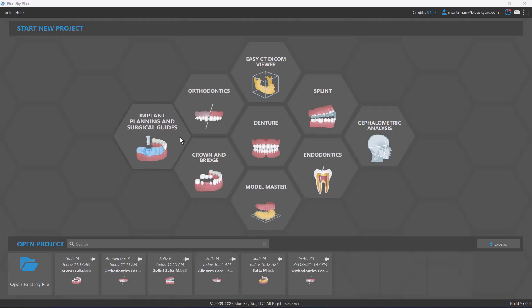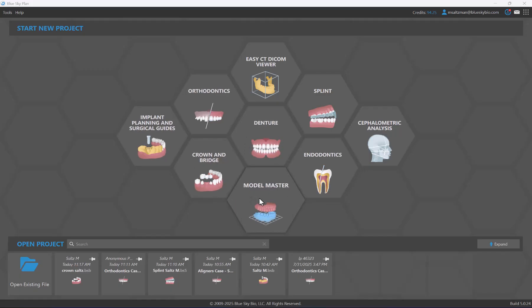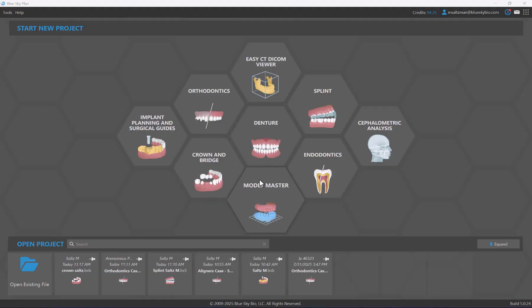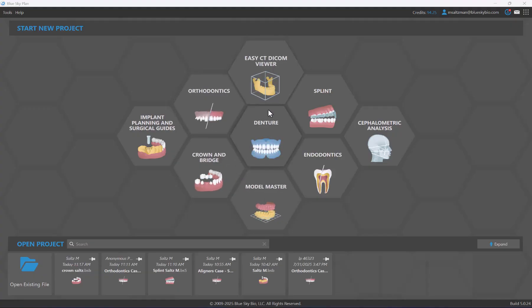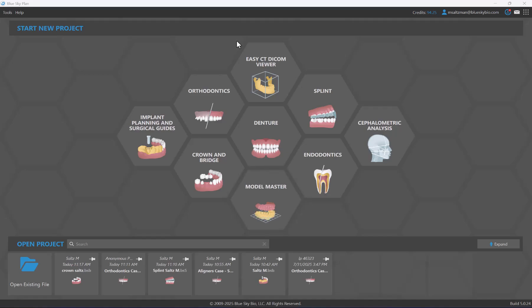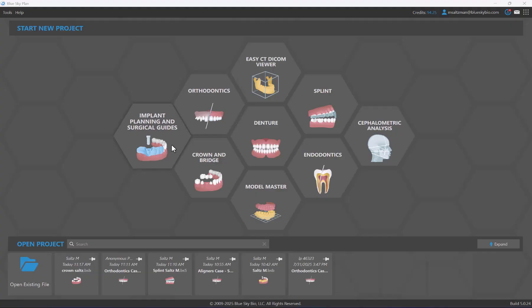Some of the features are clear and obvious, but we also have a lot of powerful functionality that may be less apparent that we've built into these introductory screens as well. There are three main introductory screens — we're looking at the first one now, which allows us to start a new project or to open a project.